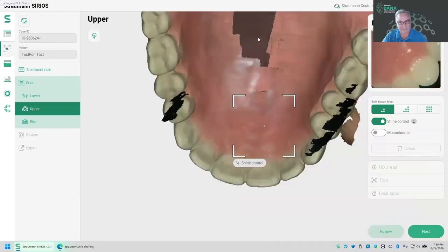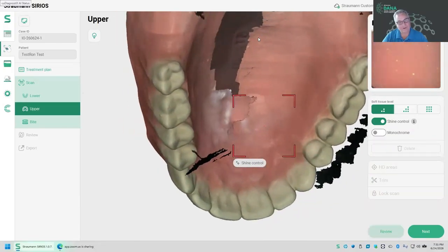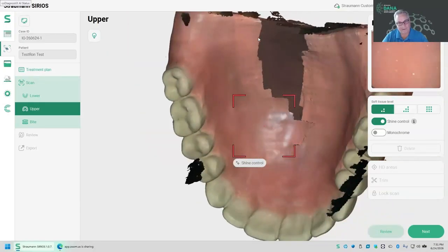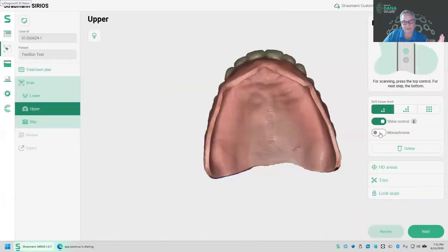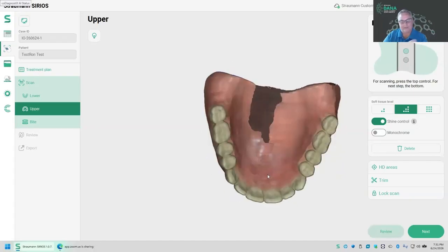Just that one part, it says, hey, I don't know where the surface is because I can't see anything. It's all reflective and smooth and there's no contour. I'm going to change the setting here. Didn't mean to turn off my scanner, causes it to clean. Okay, I'm going to change this one setting here and let's see if we can fill that in.